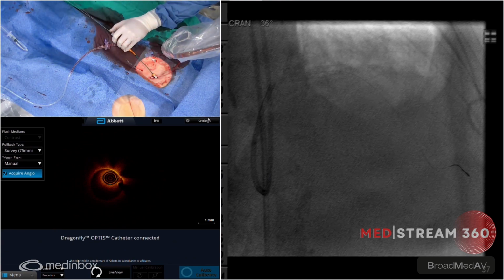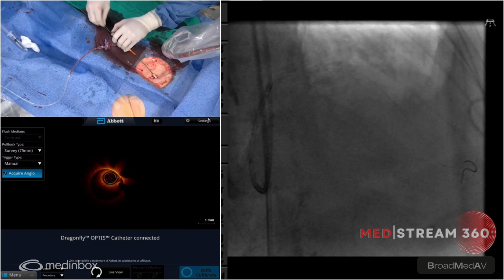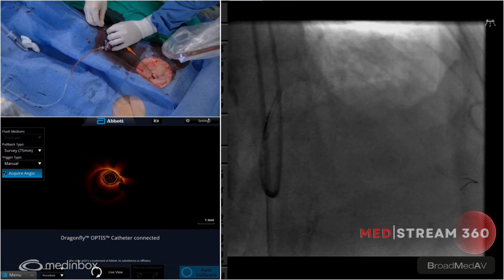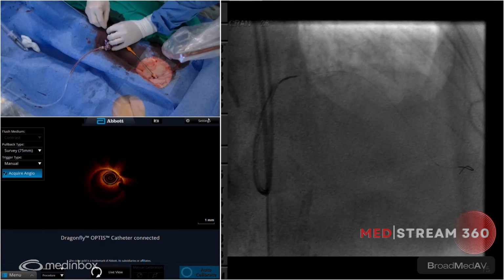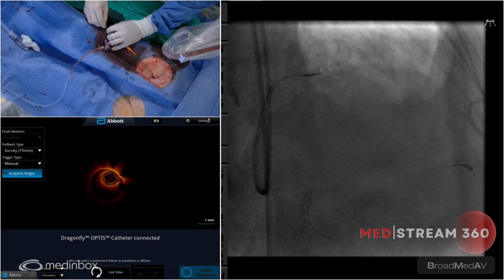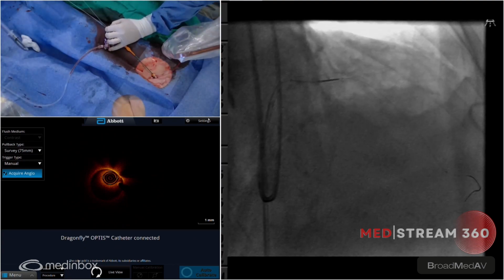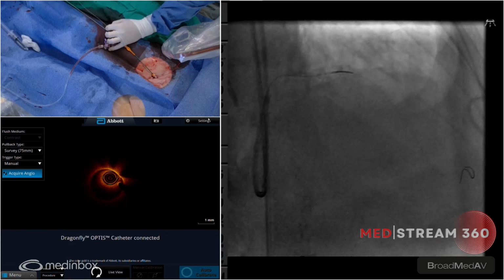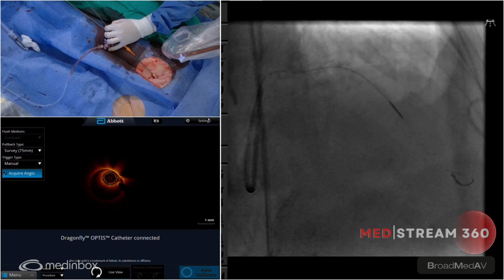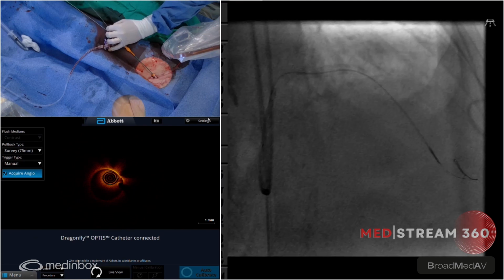Perfect. You can pin it there for me. Let's come down with the trapper. Trapper down, 12. And this is the spiral we have, right? Correct. Perfect. What I usually do is use just a little bit of a spinning motion, trapping the wire with my pinky. A couple of turns, see how it moves. And I think it's moving freely without much issue. Beautiful progress. And again, I'm going to drop my RotoWire as deep as possible to give myself support, so I'm not going to worry about it. I think that should be enough.